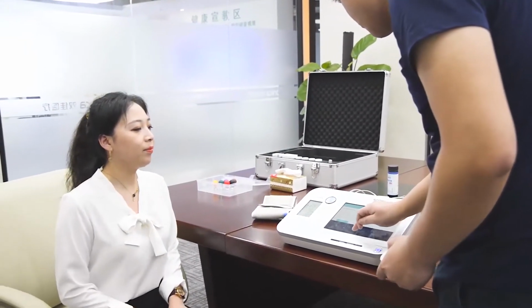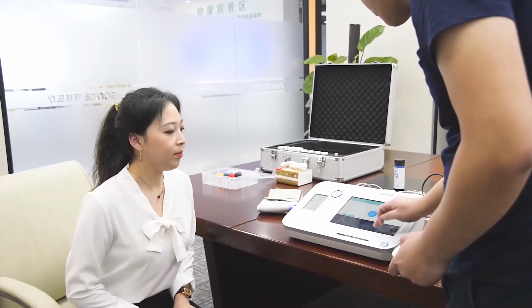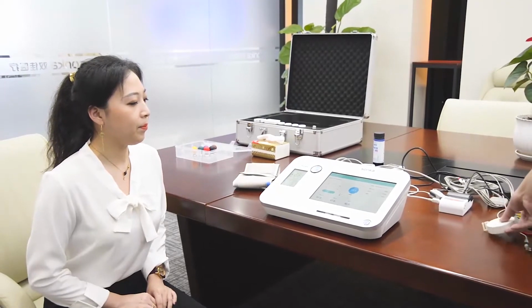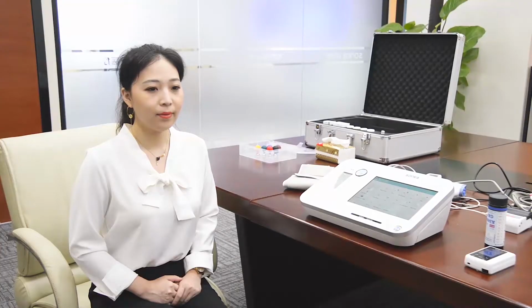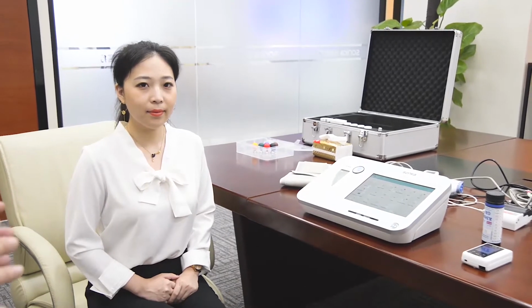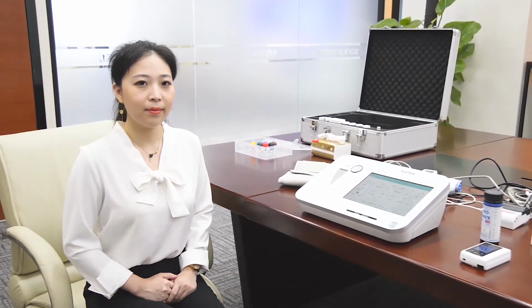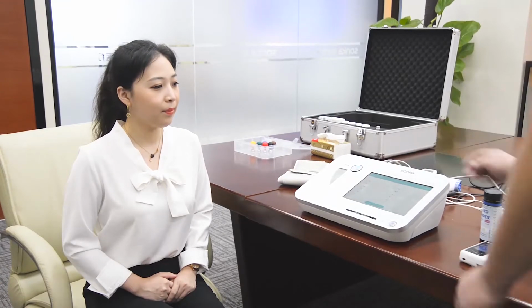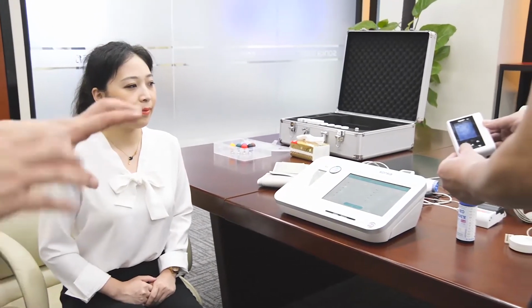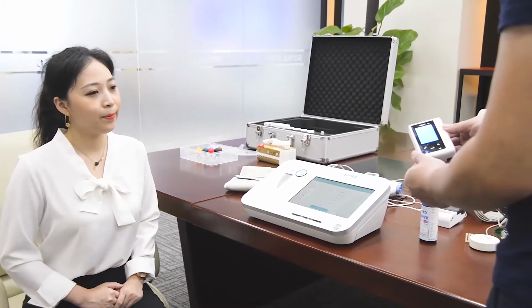We manually input the result here, and this data can be used for later analysis. Now, for the next step, we are going to test the urine. Here, we use water for demonstration. This one is the urine tester. It is connected with the machine by Bluetooth.